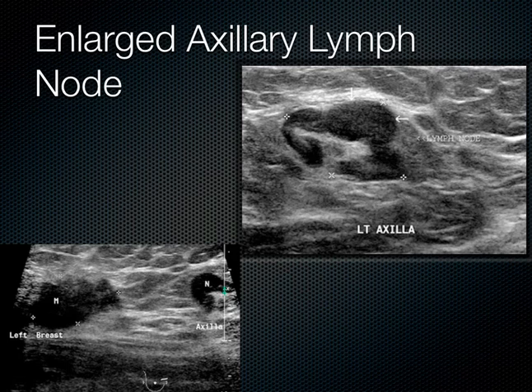And this ultrasound image here is of the left axilla in a patient who's got this hypoechoic group of lymph nodes, and the metastasis is seen here. So we can see this lymph node involvement along here, and so when you get metastases to the lymph nodes, you look up in the axilla. This is the kind of thing that you can see, this very abnormally shaped lymph node with these lobules to it. I would just generally say very enlarged lymph node. And the same thing's going on over here.